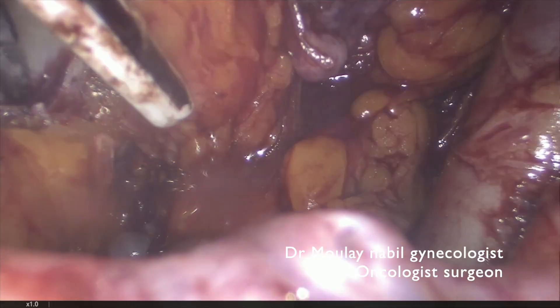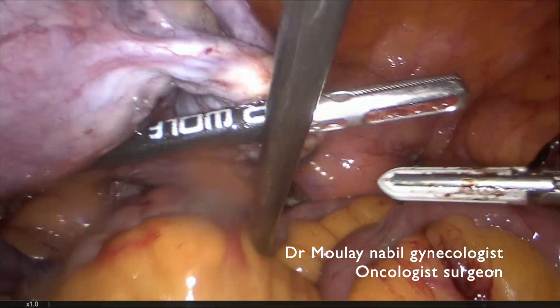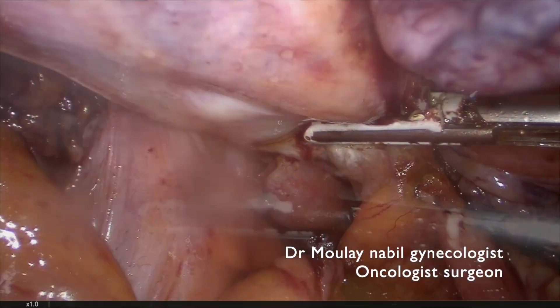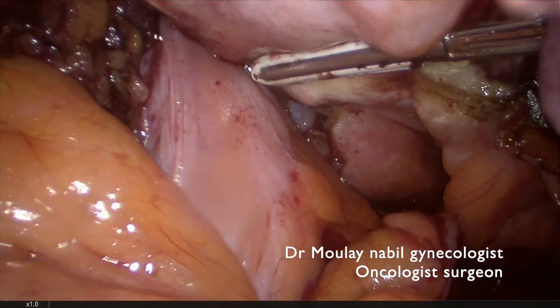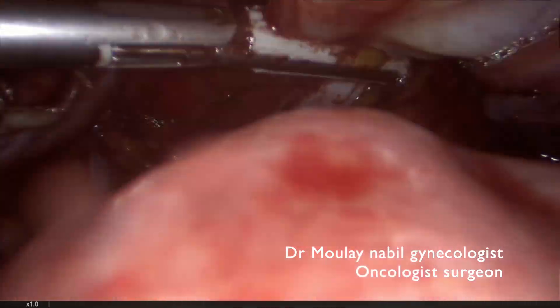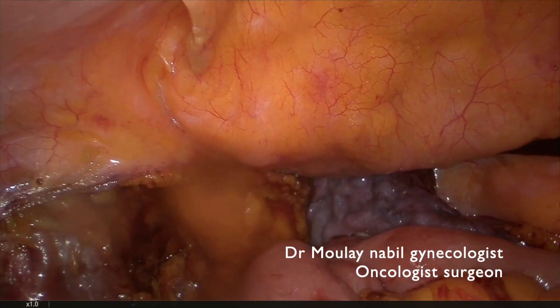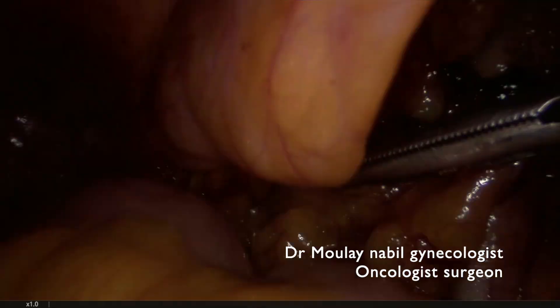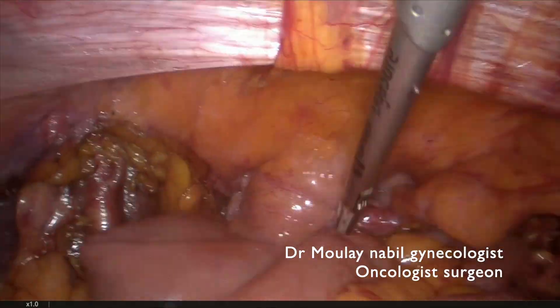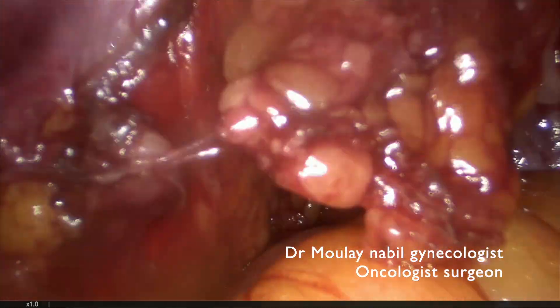We cut the lateral aspect of the vagina and the posterior aspect of the vagina. The procedure is quite bloodless. We cut the lateral part of the vagina and complete the colpotomy. The hysterectomy is done. Let's remove the uterus from the vaginal cuff, then remove the nodes collected during the pelvic lymphadenectomy — first the nodes on the right, then the nodes on the left.